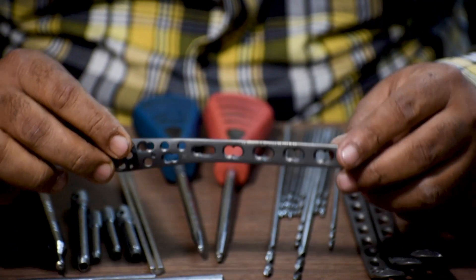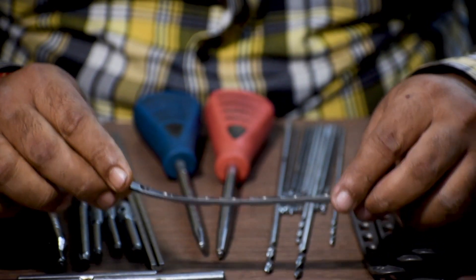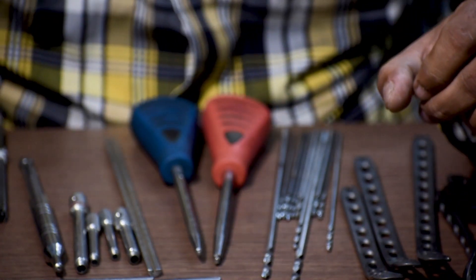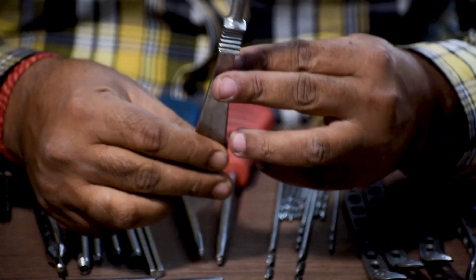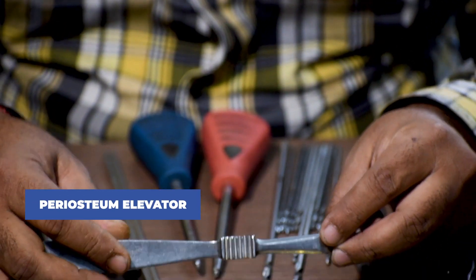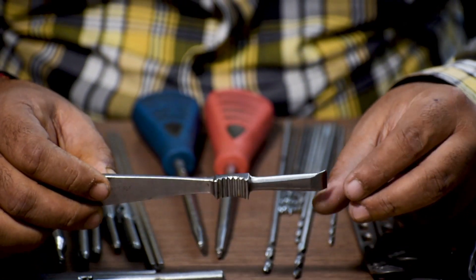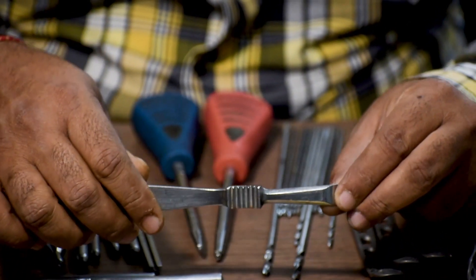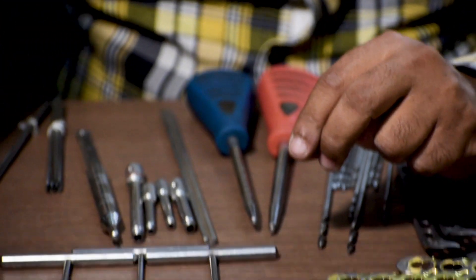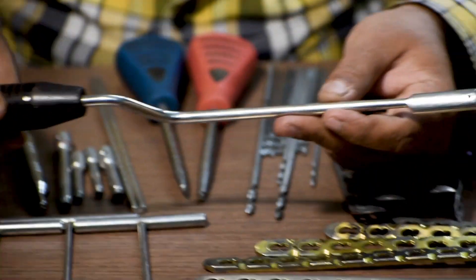First, the surgeon will make an incision at the fracture site. After the incision, a periosteal elevator is used in order to lift and separate the periosteum from the bone. After this step, a MIPO elevator or tunneller is required.